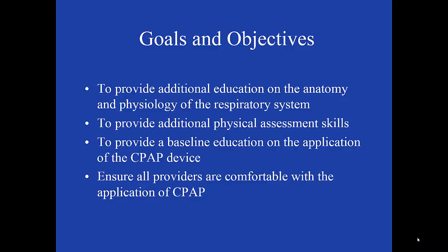The goals and objectives of this presentation are to provide you with additional education on the anatomy and physiology of the respiratory system, to provide additional physical assessment skills, to provide a baseline education on the application of the CPAP device itself, and to ensure that all providers are comfortable with the application of CPAP and specifically with the application of the CPAP device that we have here at Lancaster EMS.